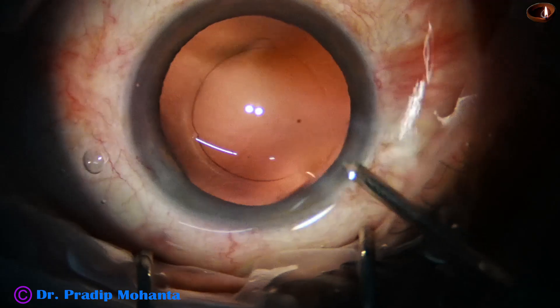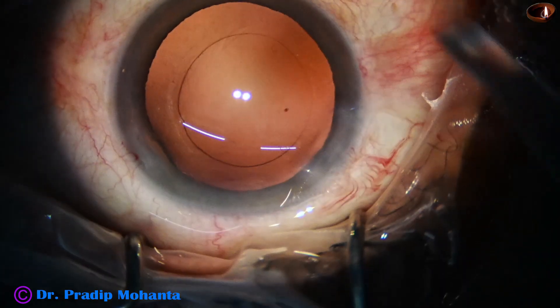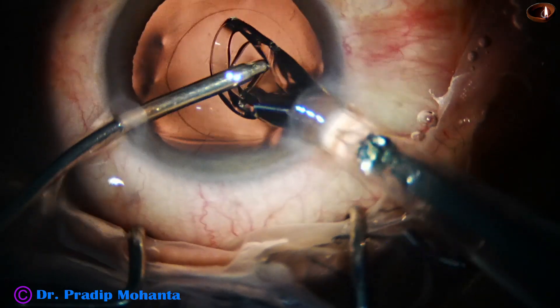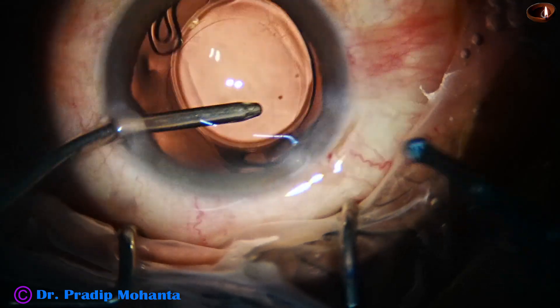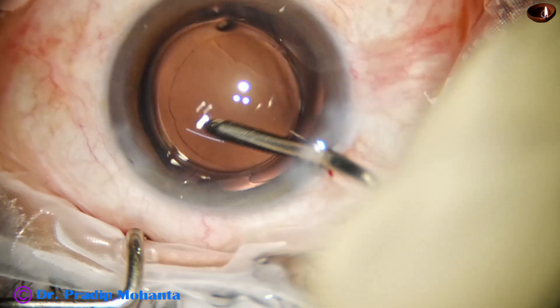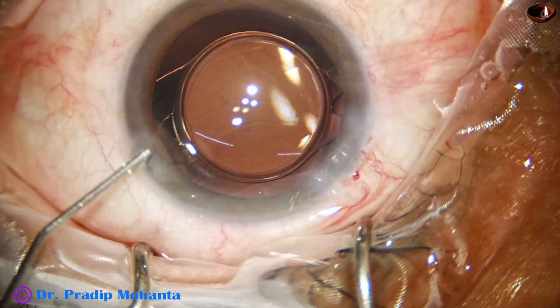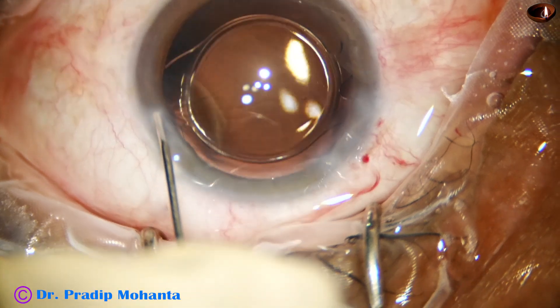Now this is polishing of the posterior capsule by the irrigating probe itself, and here goes the intraocular lens. Hydro-implantation of the lens is done — the left hand holds the irrigating cannula, and just by pushing it, the lens goes into the bag. All single-piece lenses can be placed in the bag by this hydro-implantation technique.